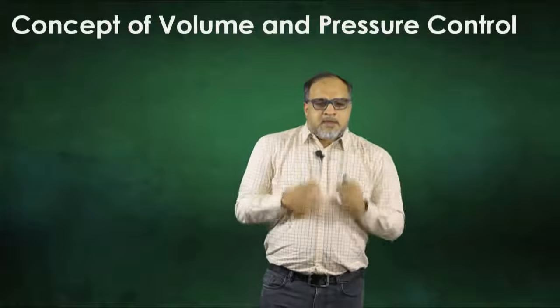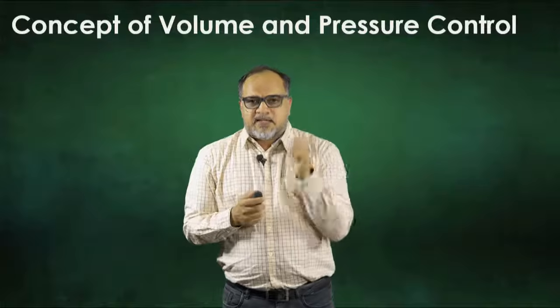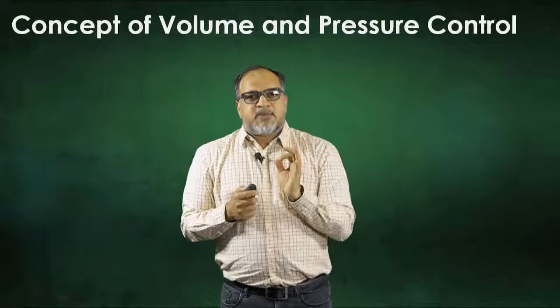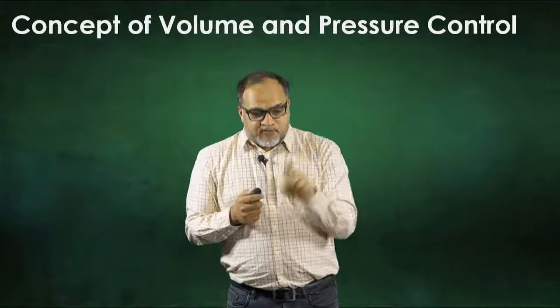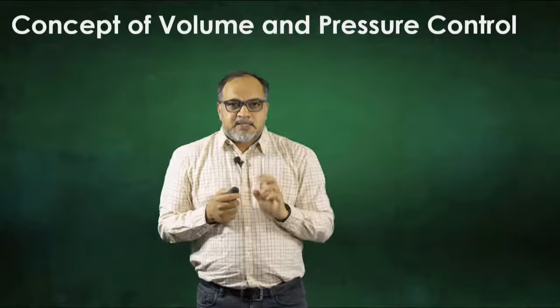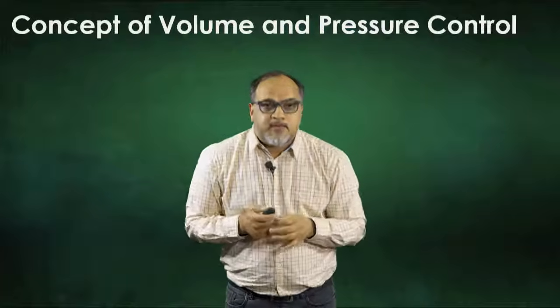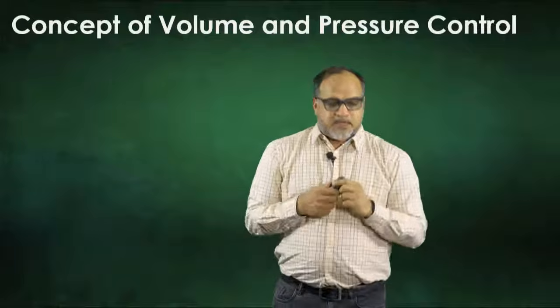Fine. So far we understood two things. One is that the ventilator is a stupid child with an ambu bag. Then it will ask the first question: who will give the breath? You have to tell it whether the patient will trigger it or the ventilator has to trigger it. Then the second question it will ask is कि हवा कितनी डालनी है, how much air do I need to give. Now there comes the concept of volume and pressure control.